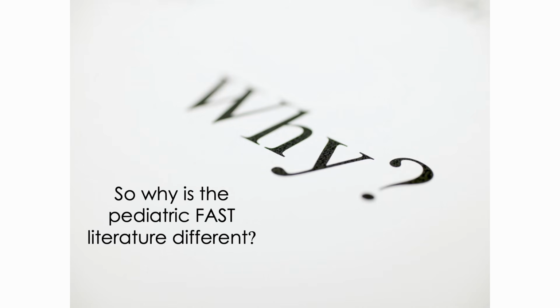We've just gone over all the steps of the pediatric FAST exam, but it's important to note how and when to use this exam in the pediatric population based on data and literature review. It turns out that the FAST exam performance in children is different when compared to adults. The presence of fluid does not dictate operative intervention alone. The absence of fluid does not rule out injury.